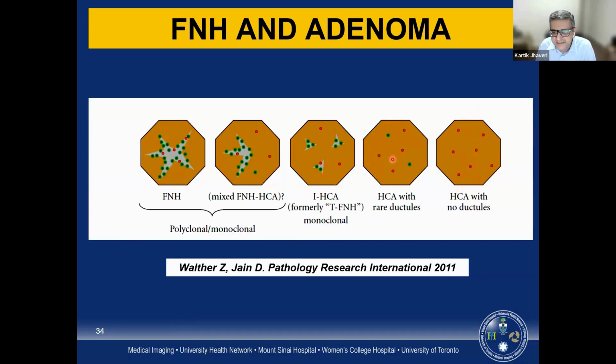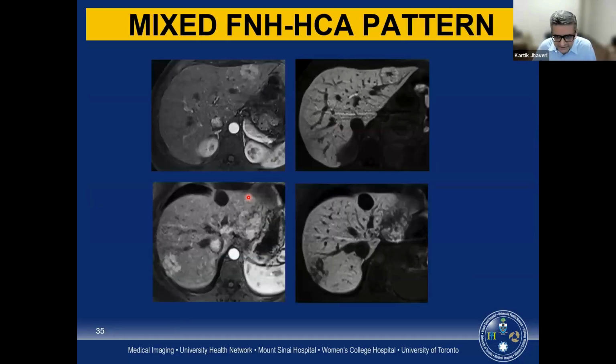And then you have these mixed states in between, where you have an inflammatory adenoma sitting right in the center. And then on either side, you can have mixed types of lesions. And this can result in somewhat confusing or non-diagnostic appearances for distinguishing the 2 extreme ends of the spectrum with a hepatobiliary phase contrast agent.